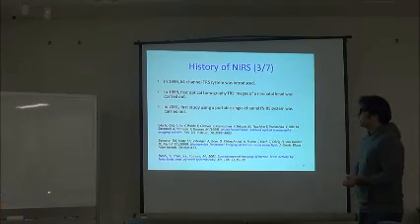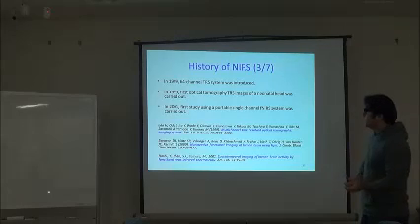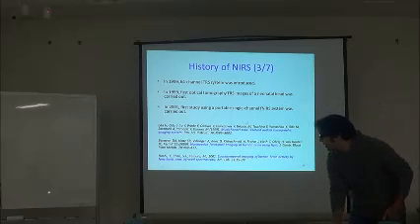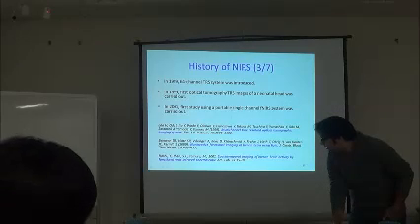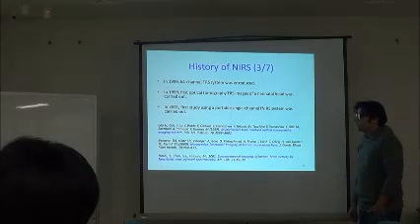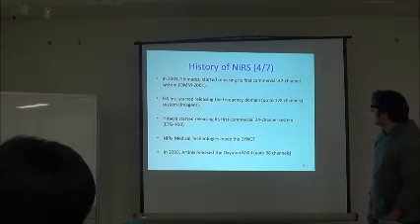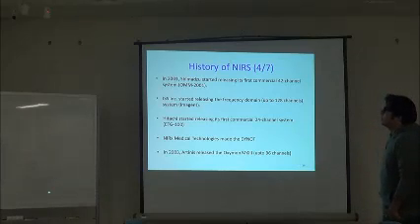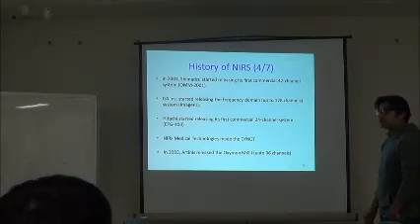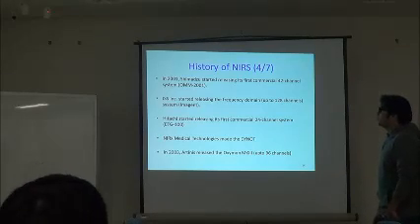And in 2001, there was the first study using a portable single-channel fNIRS. It was again carried out by the same guy, Professor Hoshi. So portable systems came in 2001. Then in 2001, Shimadzu, a big name in making fNIRS systems and other optical systems, started releasing its first commercial 42-channel system.